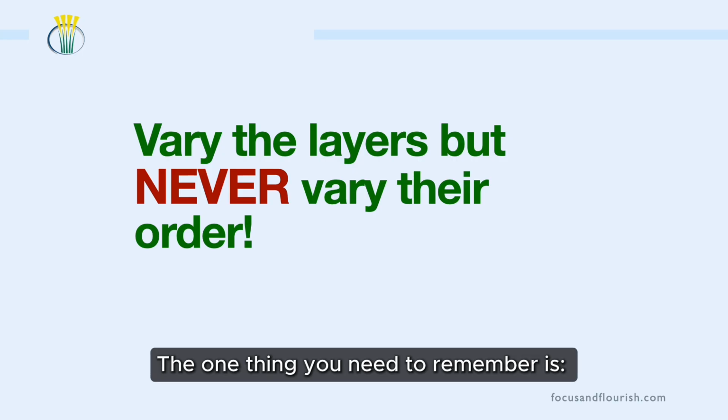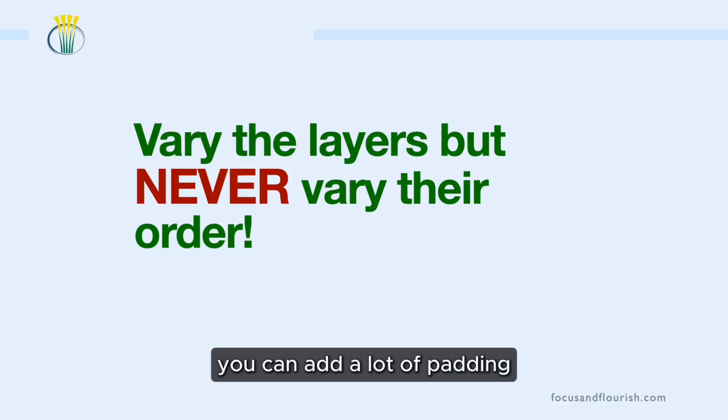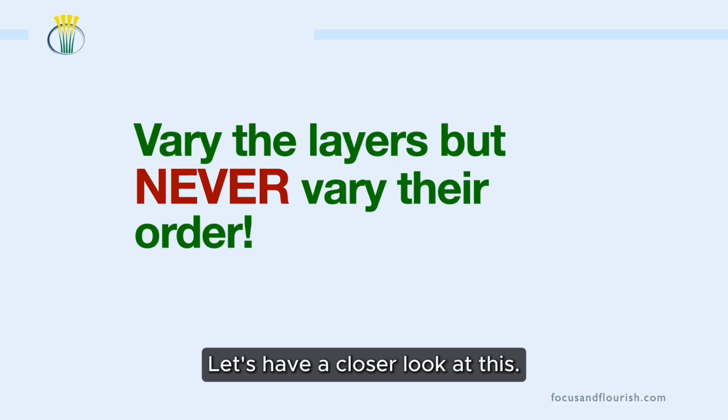The one thing you need to remember is you can never vary their order. You can maybe omit the contact layer. You can add a lot of padding and make your padding layer really thick, but you cannot change the order in which you apply the materials. Let's have a closer look at this.